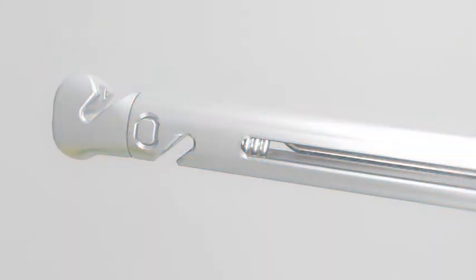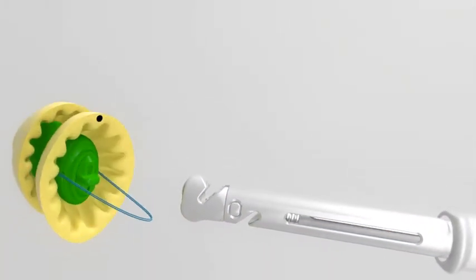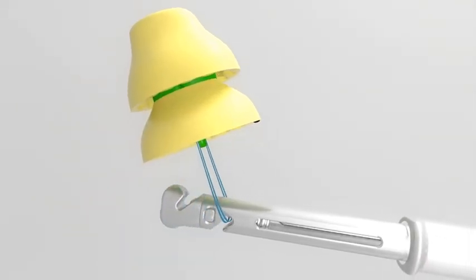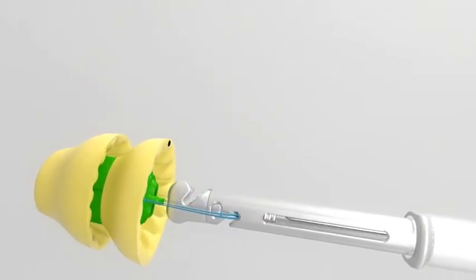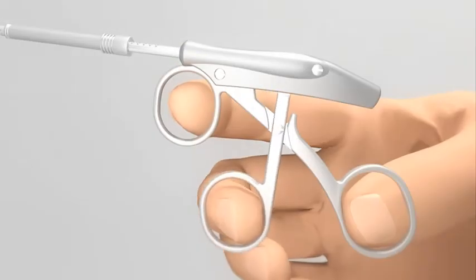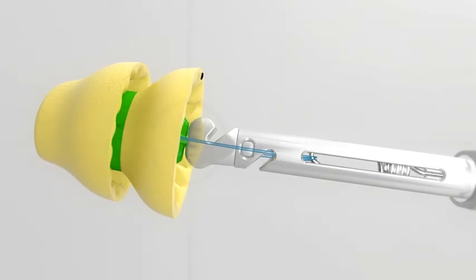Ensure that the black dot is in the superior position. Thread the removal loops into the loading notch. To do so, position the sizer face down and guide the loops into the notch. Once both loops are in place, slowly release the moving tension ring to retract the loading hook and place the sizer on the tip of the tool.